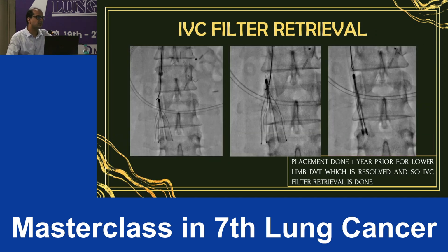So many times we are doing a filter for pre-surgical planning, and there the filter needs to be taken out, because the risk factors have gone, and this is when the filter needs to be retrieved after placement. If it is a palliative setting, it can be kept in the patient's body.